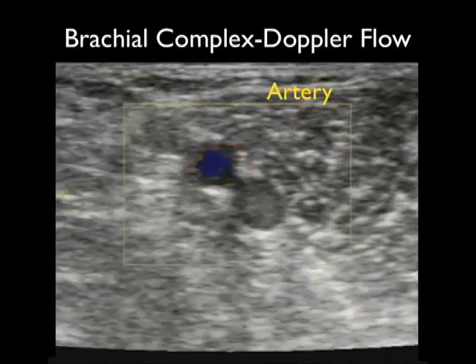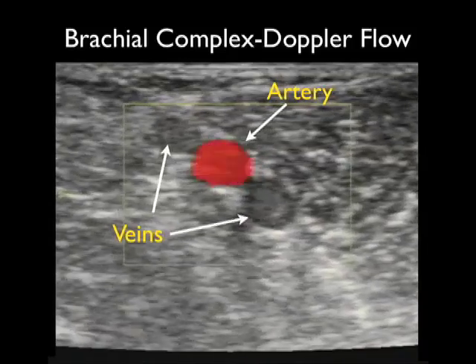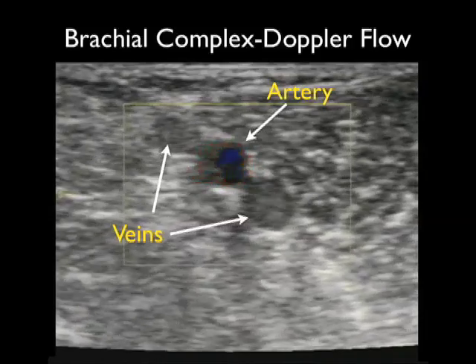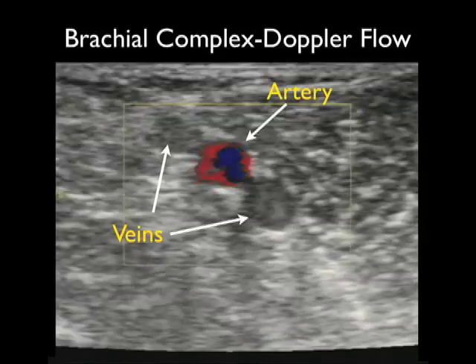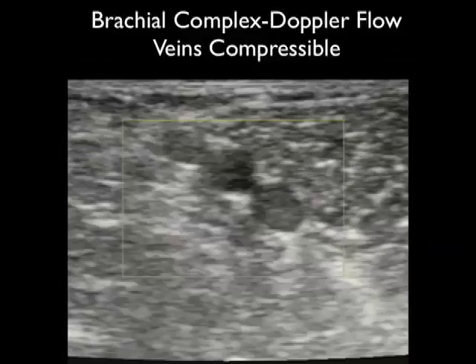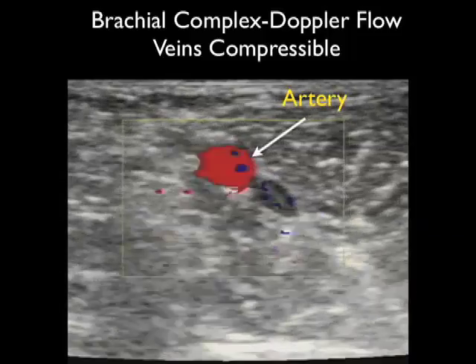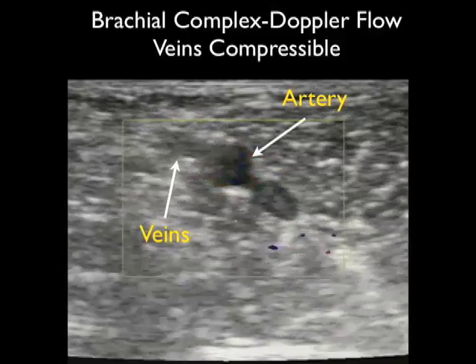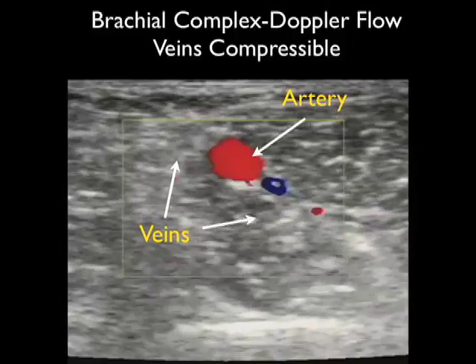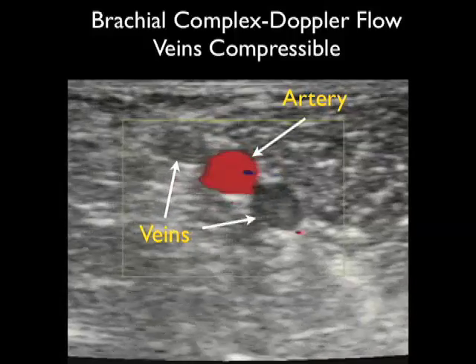Notice that the artery has less distensible walls and stays open even as we compress down with the probe. We can further differentiate vascular structures by applying color Doppler flow. Notice as we apply Doppler that we see arterial pulsations in the central brachial artery. However, notice the absence of any flow within the deep brachial veins due to sluggish flow within those structures, compared to the brisk arterial flow in the central brachial artery. Putting it all together using Doppler flow and compression, the brachial artery stays open with brisk arterial pulsations while the two flanking deep brachial veins compress completely and show a lack of vascular flow.